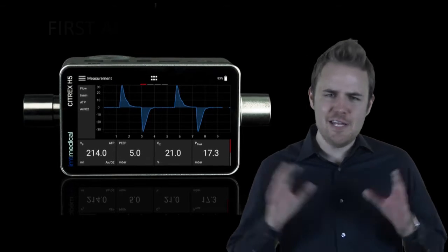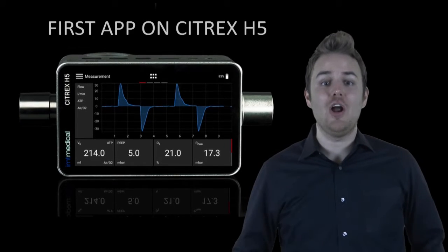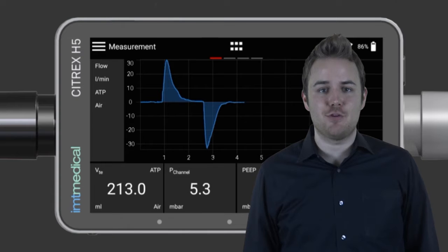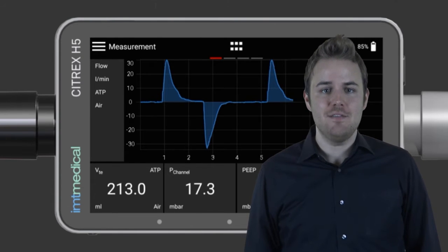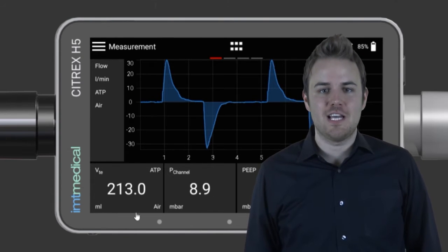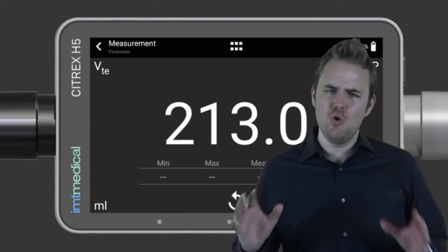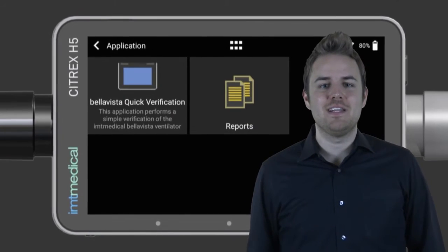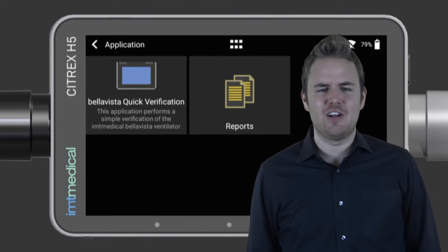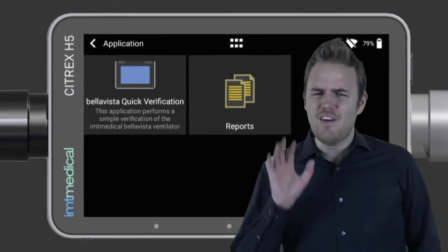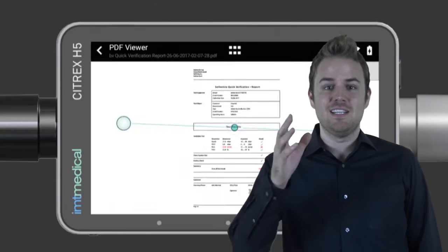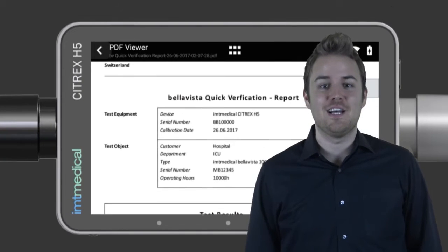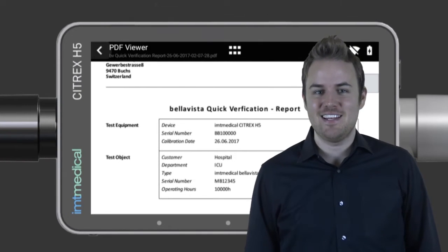IMT Medical is introducing the first app on its CITREX H5 gas flow analyzer, bringing ventilator testing to a new level. With the app, you can test a ventilator in less than five minutes — test report included. Sounds exciting, right?